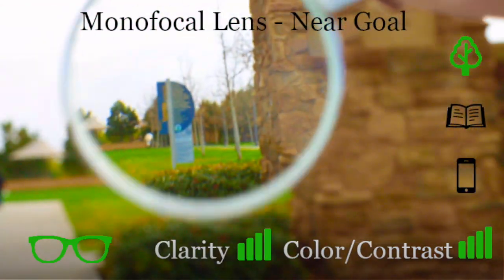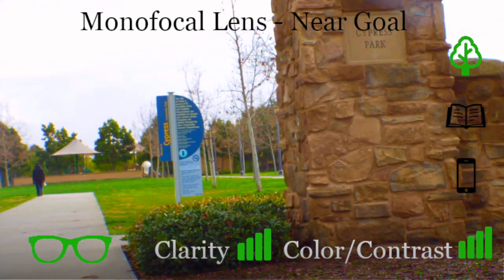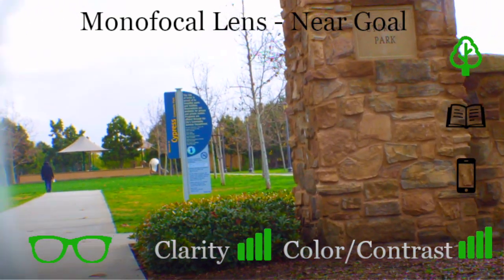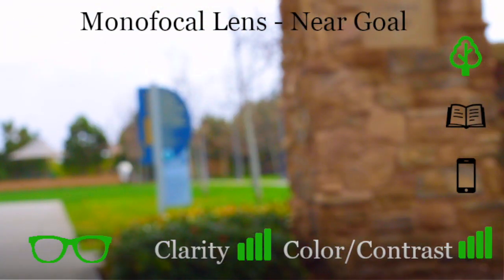To see out in the distance, we can put a pair of glasses over your eyes like this, and it'll be really clear out in the distance. This is a great option for people who love to read, no glare and halos at night, with vibrant colors and contrast.